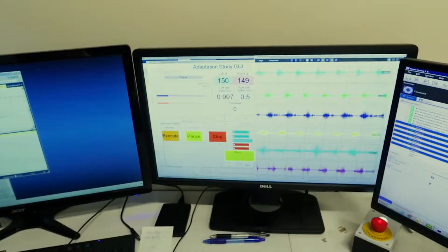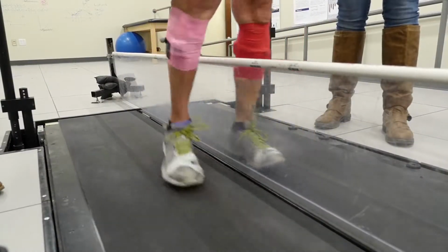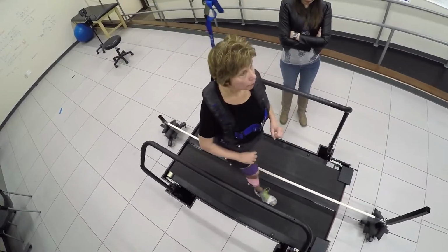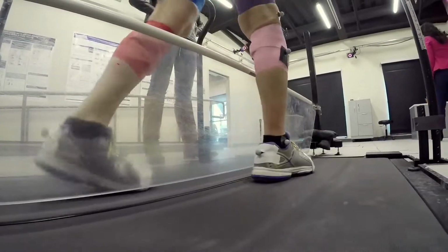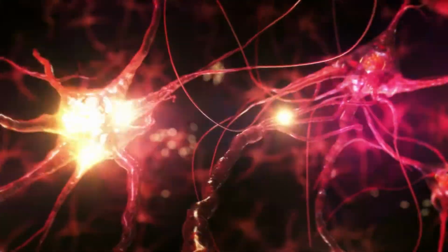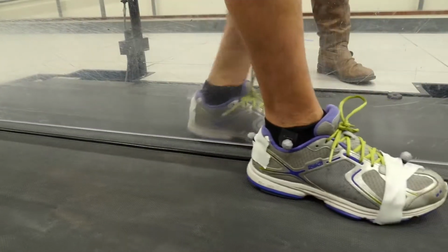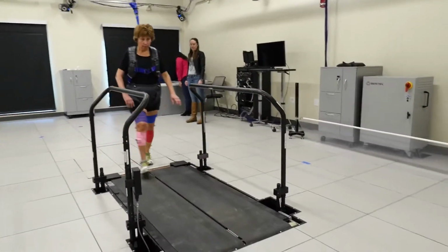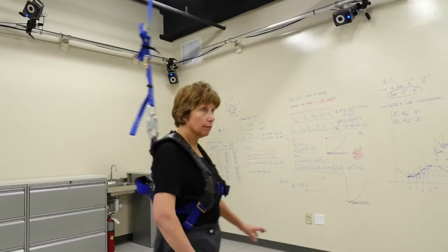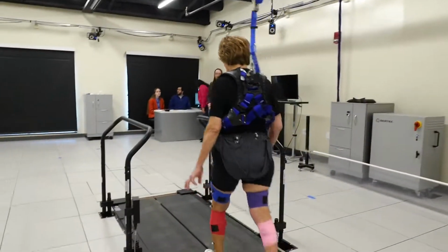So the question is, how can we help the gait rehabilitation of these patients? The belts on this treadmill move at different speeds, so Vicki has to work her affected right leg harder than her left. The corrections that they are making are training the neural commands that generate walking movements. But they found what's learned on the treadmill often doesn't stick. Okay, perfect. A common finding is that patients are able to adapt and correct their movements while they're using the device, but as soon as they let go of the device, then their corrections don't carry over as much.